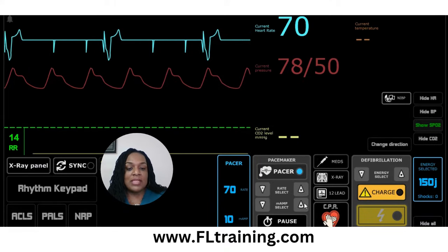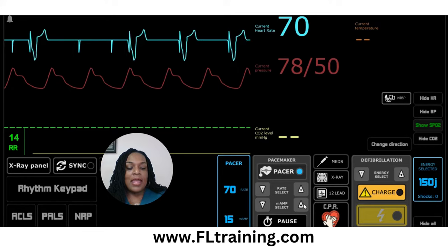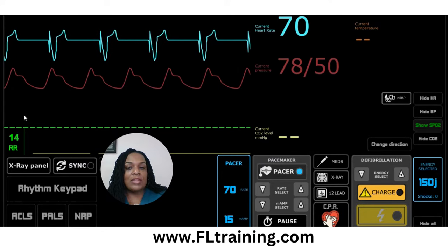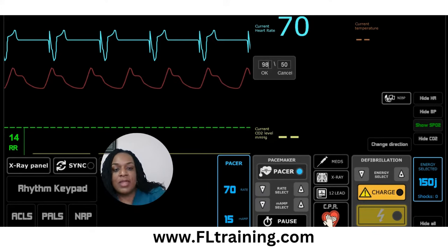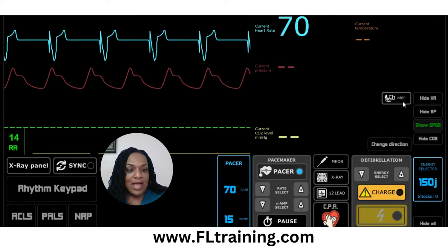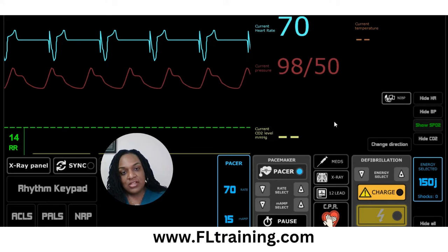We're going to increase our milliamps — follow whatever your manufacturer's guidelines are. Now according to our monitor we have 100% capture: after each pacer spike, you have a QRS complex. If you check the patient's apical or radial pulse right now, hopefully it's going to coincide with the heart rate — you should feel 70 pulsations per minute — and you should also start seeing improvement in blood pressure. You've now bought yourself and your patient some time. They can get to the cath lab or wherever they need to go. If they need an implanted pacemaker, or if you need to administer digibind for a patient on digoxin with elevated dig levels, that's something to consider now.